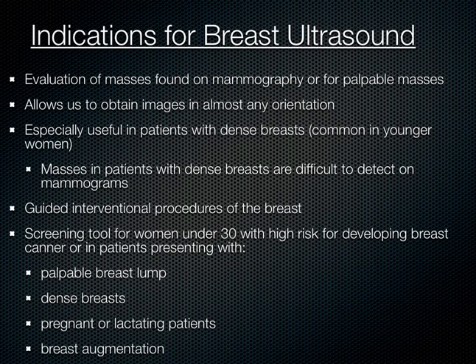First of all, anytime somebody has a mass that was found either through palpating their own breast, or a physician palpates their breast, or it was found on a screening mammography, this is another way to evaluate that mass, as you will see. And one of the advantages of ultrasound is that it allows us to basically scan in any orientation we want, and to get a really good three-dimensional image in our mind, we may need to move that probe in many different planes in order to do that.